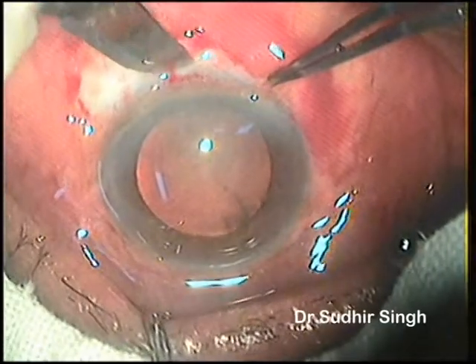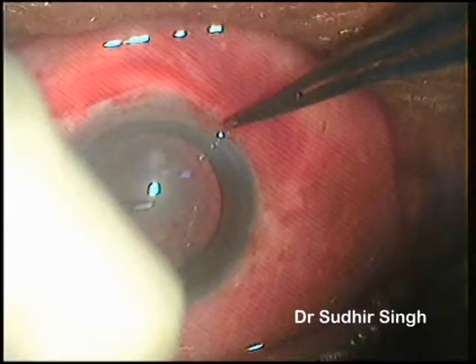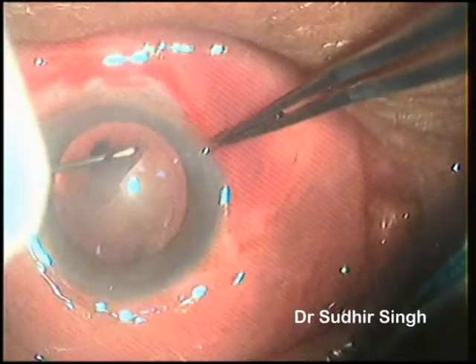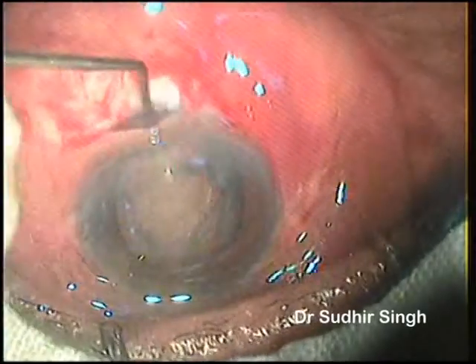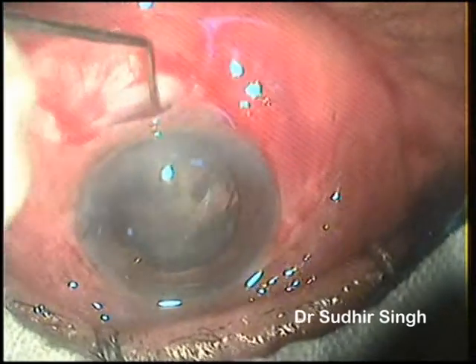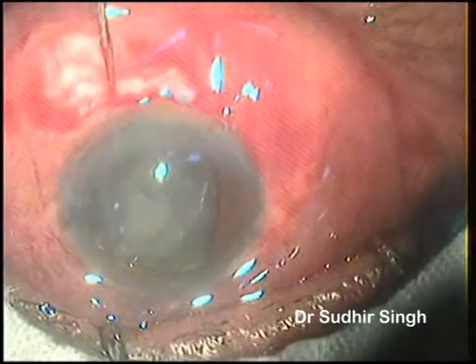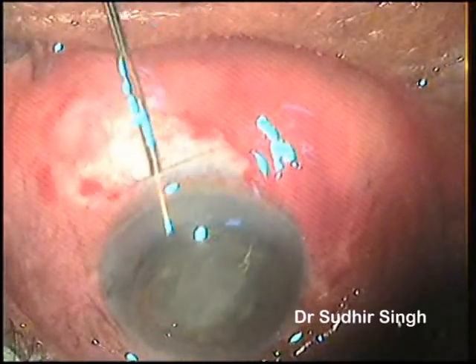An eight mm tunnel incision is made with a crescent knife. About a 7 mm capsular hexis is made by a 26 gauge needle cystotome. The lens nucleus is prolapsed into the anterior chamber with the help of a Sensky's hook. Enough viscoelastic is placed all around the nucleus.